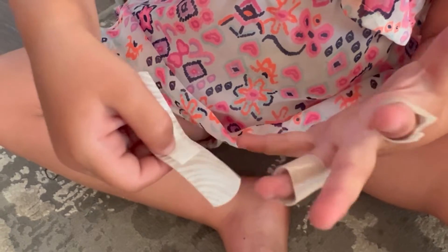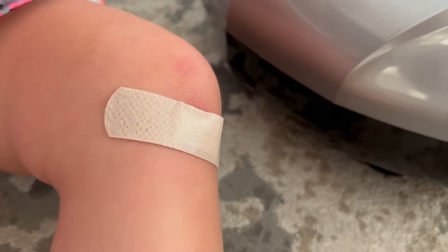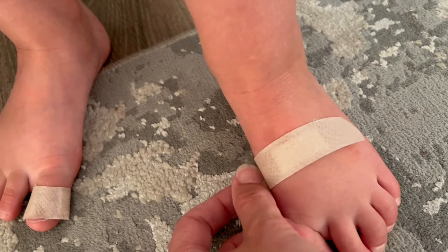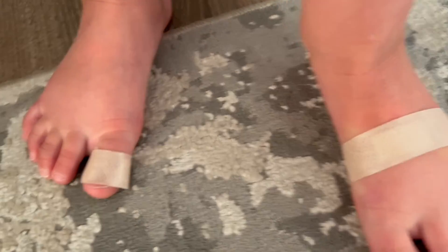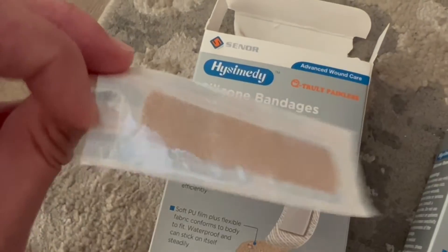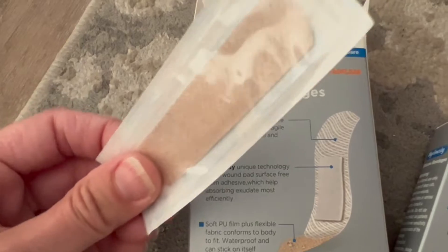These are super simple to use. One of the best things about it is that when you go to take it off, there's no tears, no crying, because it doesn't hurt. It doesn't stick like some other band-aids do where it really hurts. Perfect for kids or elderly who have sensitive skin — you get 30 in your box.